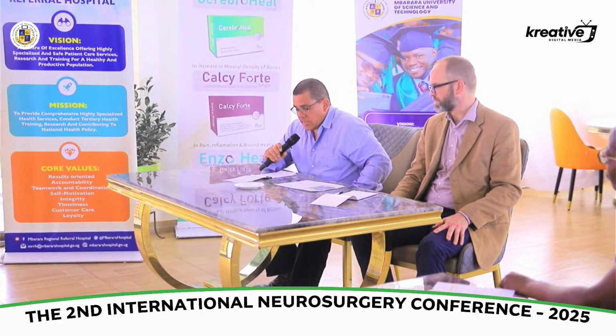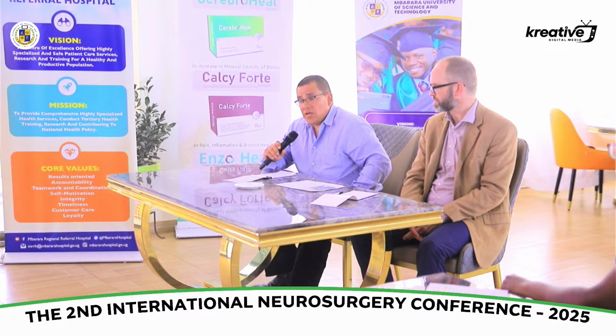As far as the Spencer's curve goes, it's just physics that was initially published to support the use of TCDs as an indirect surrogate of cerebral blood flow. And basically it shows that the smaller the diameter of the blood vessel is, the higher the velocity is going to be. But there's going to be a point in which the velocity is going to go to zero because there is no more blood going through that blood vessel. So that's basically the mechanics of why we look at that.